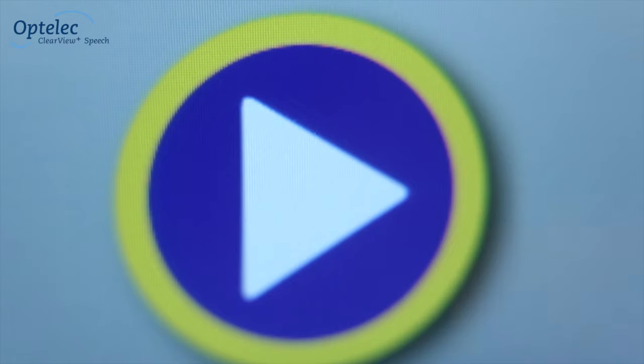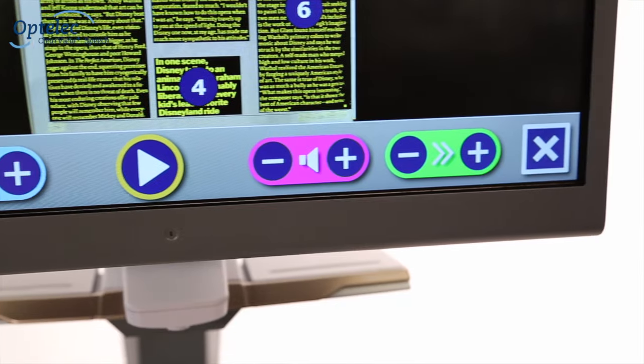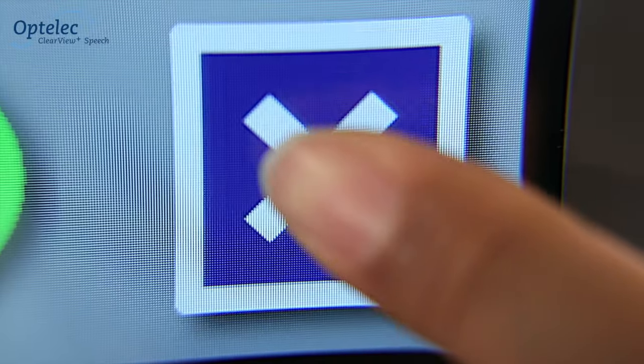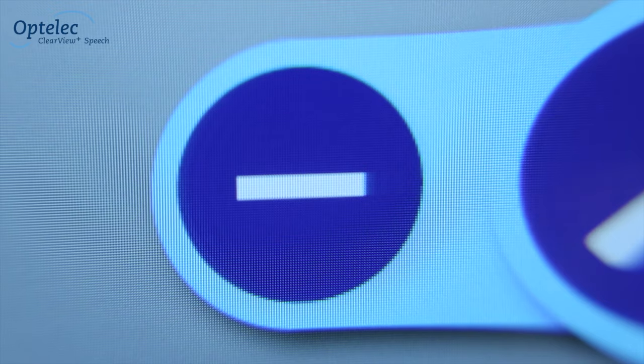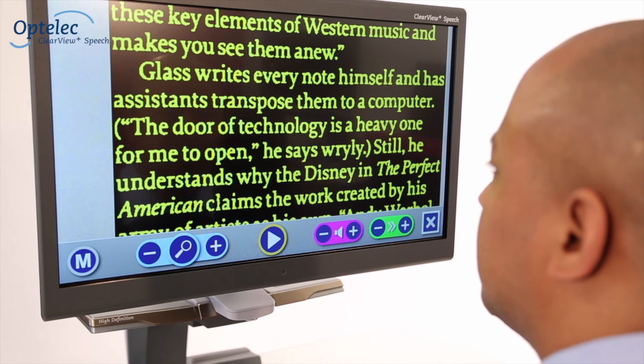The button bar allows you to pause the read aloud function, adjust the volume and adjust the speed. Pressing X will switch off the speech option and will take you back to the Clearview Plus mode. The touchscreen allows you to increase and decrease the size of your documents.